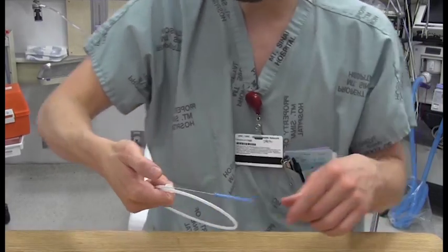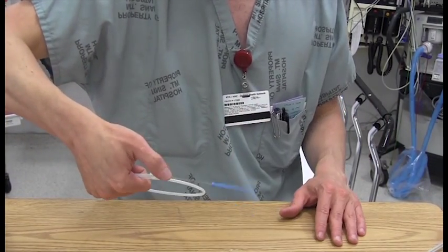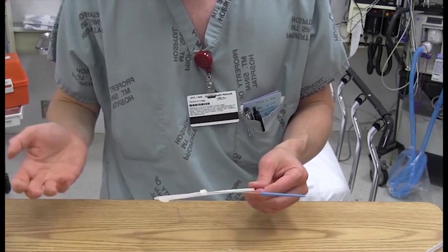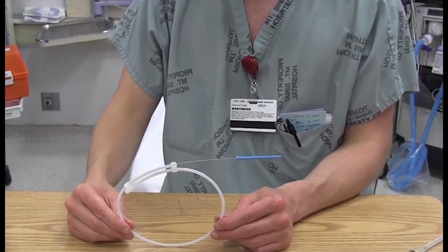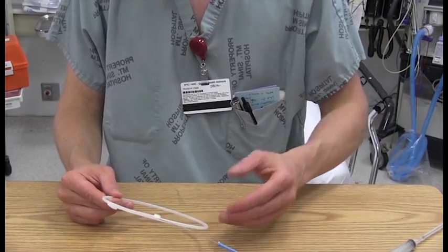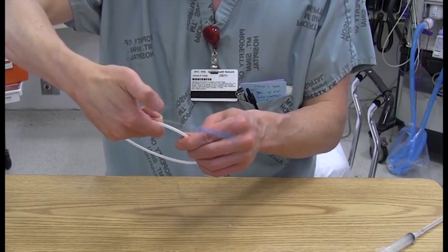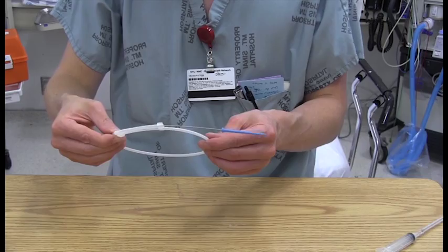Now you guys might be used to the ones with the little thumb indentations where you don't have to manipulate the wire as much. Learning that is great if that's going to be your kit for the rest of your life. But if you're ever going to run into a kit like this, and I promise you will, I think it's worth learning it this way, and then you could always adapt to the other one, but not vice versa. So managing this kind of wire where they don't have that little thumb situation, I think is advantageous, because then you can use any kit.